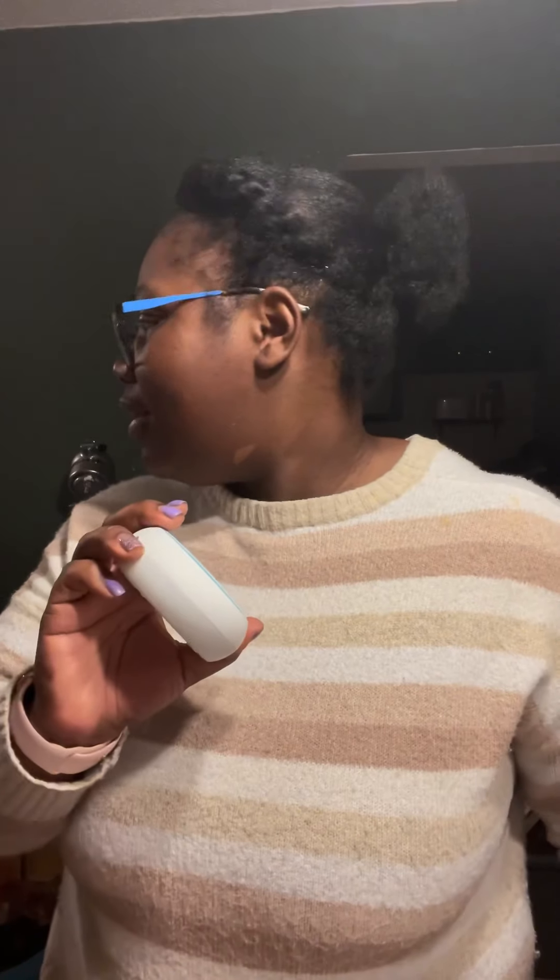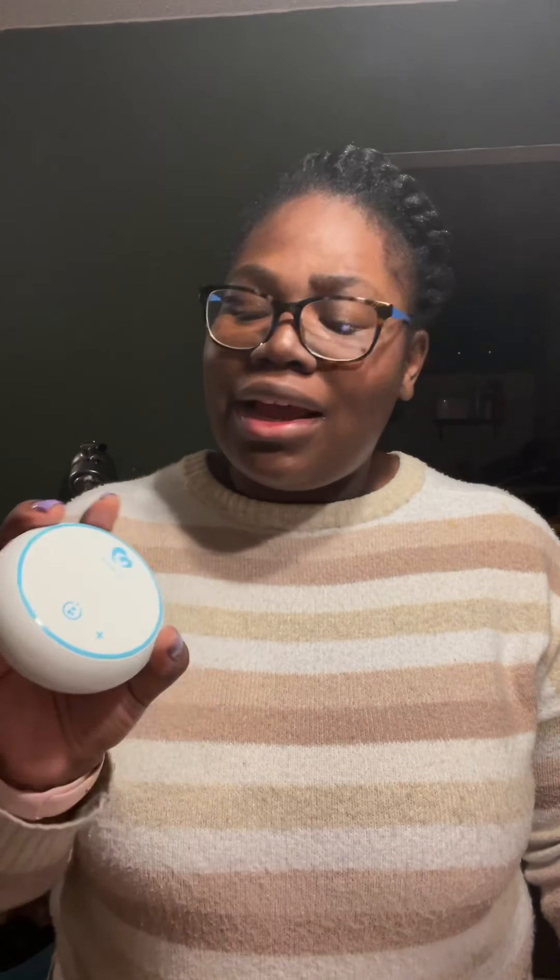I would get the other pump right now but I don't remember where I put the baby bag. When I come back I'll have it and we will compare size, suction, power, and how easy it is to carry around versus the rectangle one. I'm about to go pump with this one and then I'll be back to let you know how it went.